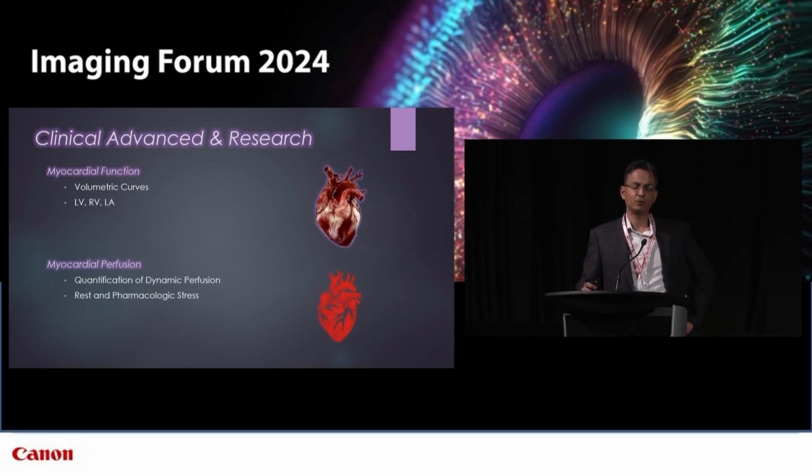Myocardial perfusion, this is an area of pretty much only research even to this day. There may be some institutions that are implementing it for clinical care, but largely this is being compared against the standard of care, which tends to be nuclear medicine perfusion, or as we've heard, FFRCT if you happen to be fortunate enough to have that tool available to you. And a theoretical ideal future state, of course, would be the ability to integrate both the epicardial flow dynamics with the myocardial perfusion with a rapid segmentation. And maybe that's a discussion we can have with folks here.